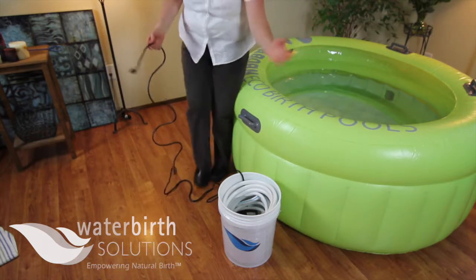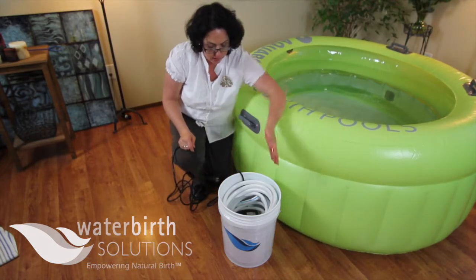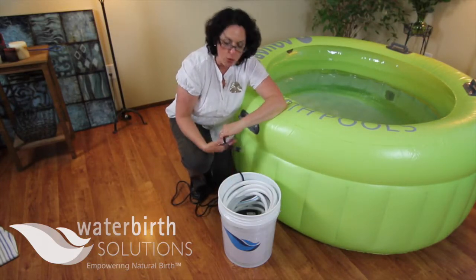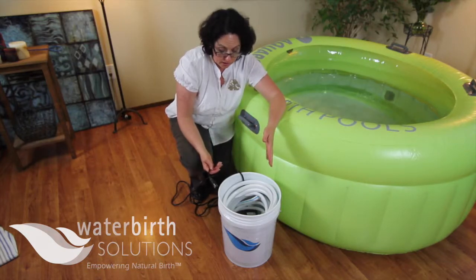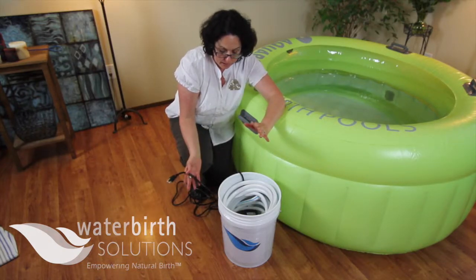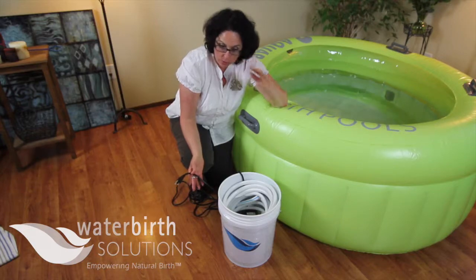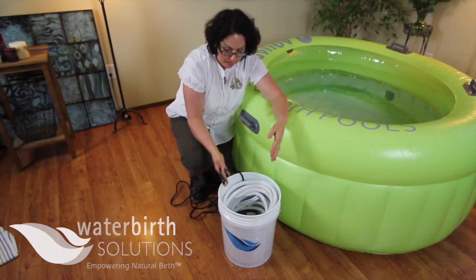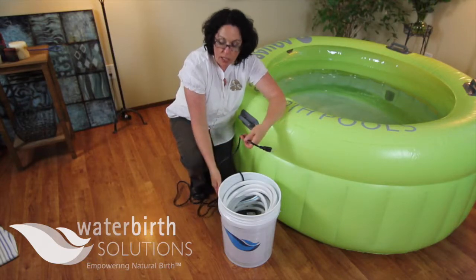You can set a timer for three minutes, and then once the timer goes off, just let the bucket sit for five minutes. Now your drain pump and your hose has been sanitized. You can empty out the bleach solution — it can go right down the toilet or a drain. You can even store the hose and the drain pump in this bucket until your next use.